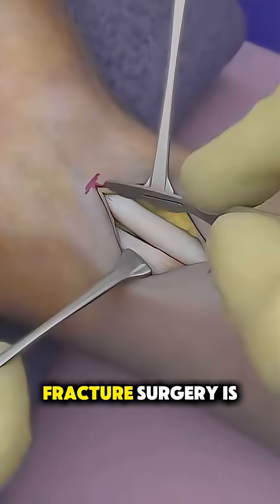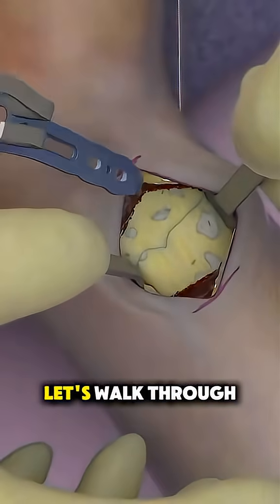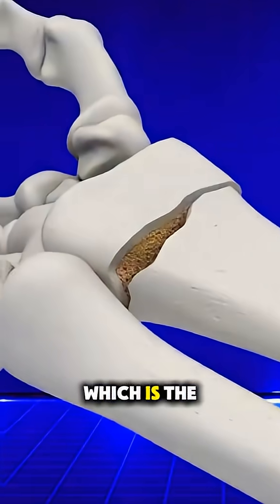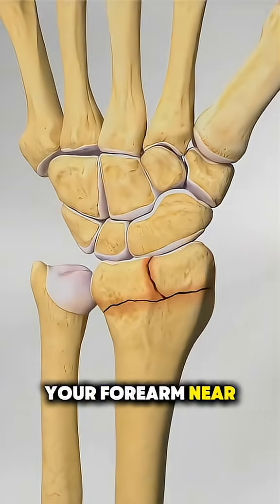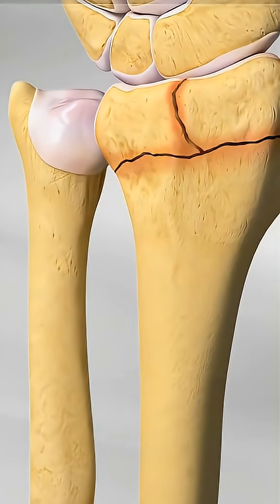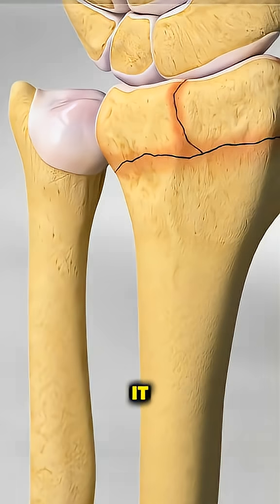Ever wondered how distal radius fracture surgery is performed? Let's walk through it. When someone breaks the distal radius, which is the larger bone in your forearm near the wrist, and the bone is misaligned or unstable, surgery might be needed to fix it.